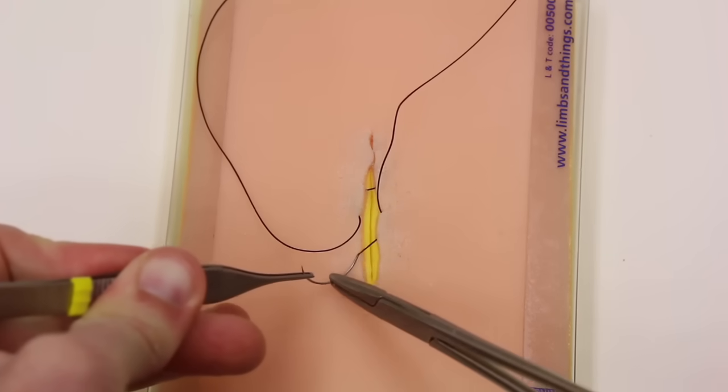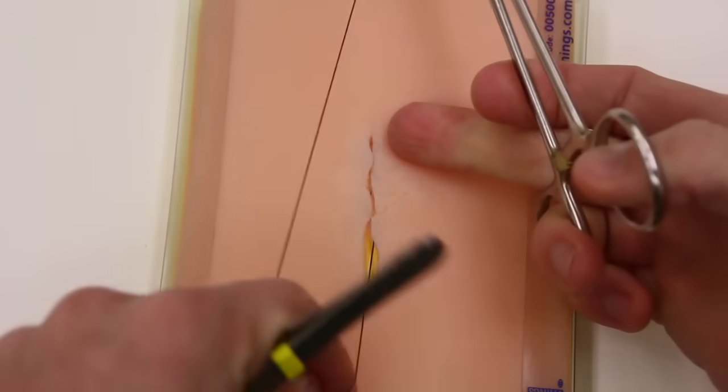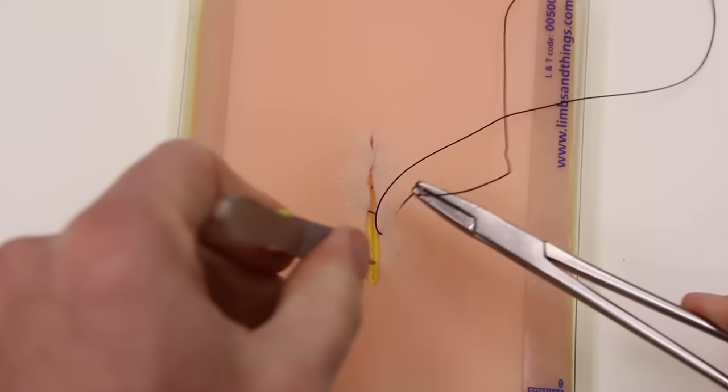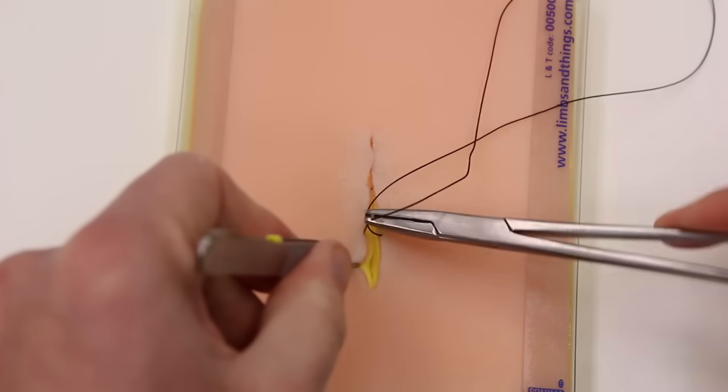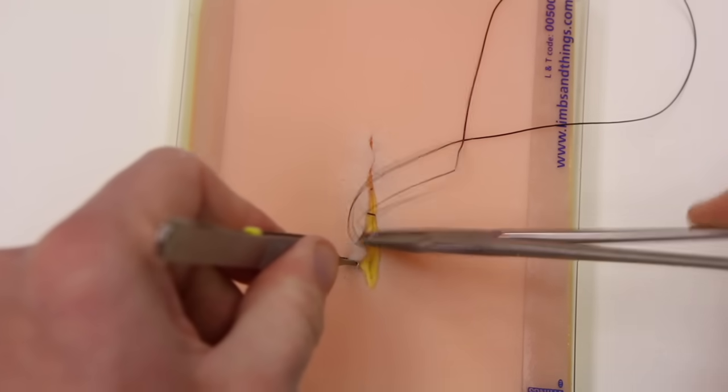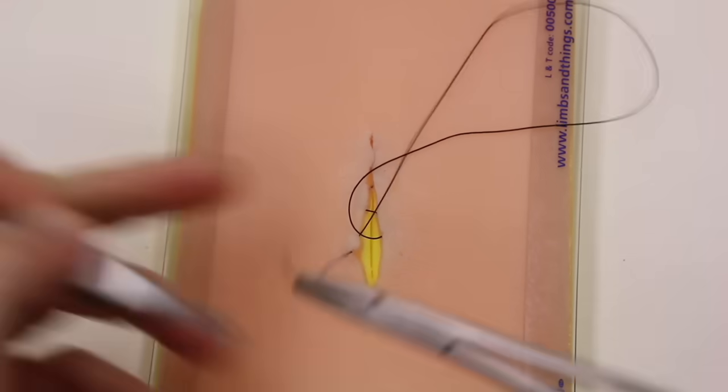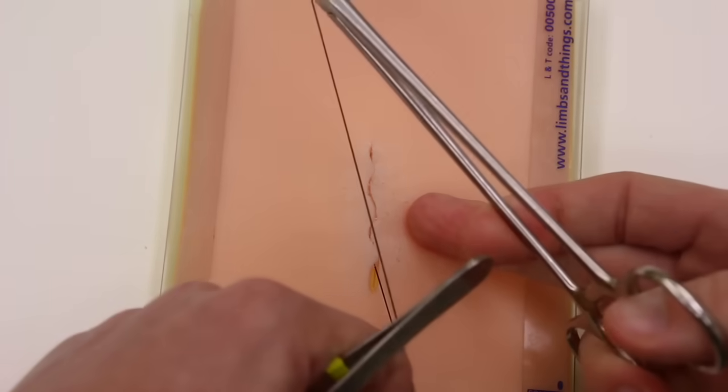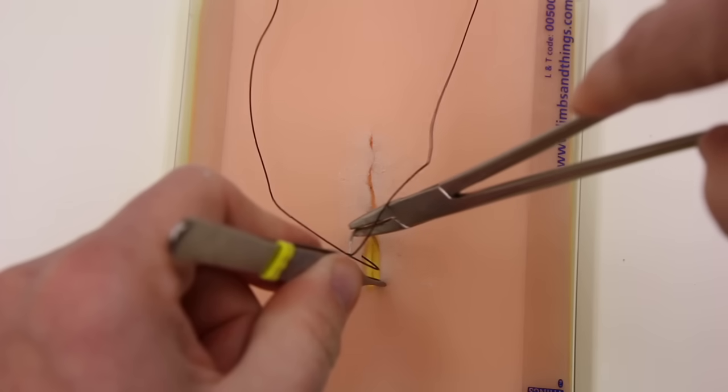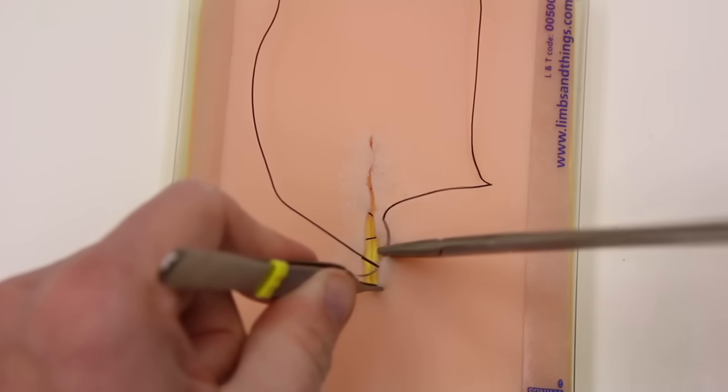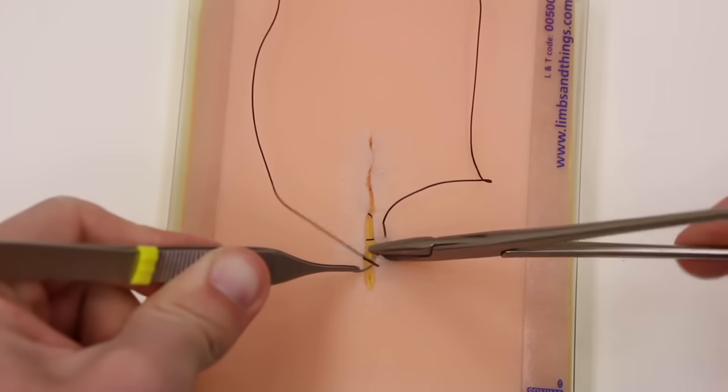In longer incisions, when you're using monocryl, you can sometimes take two or three bites and then pull tight. But it is best practice, particularly if you're using brands that are not monocryl that will break if you put too much effort on it. So pulling taut after each pass is essential in that condition.